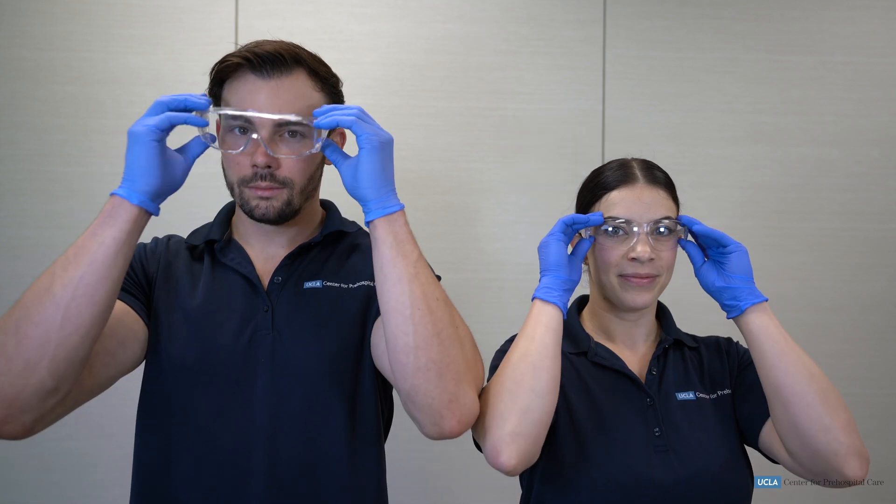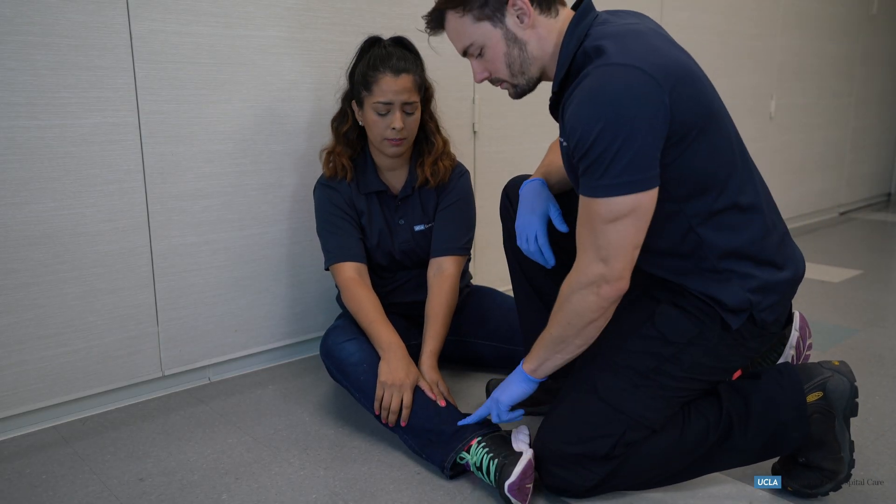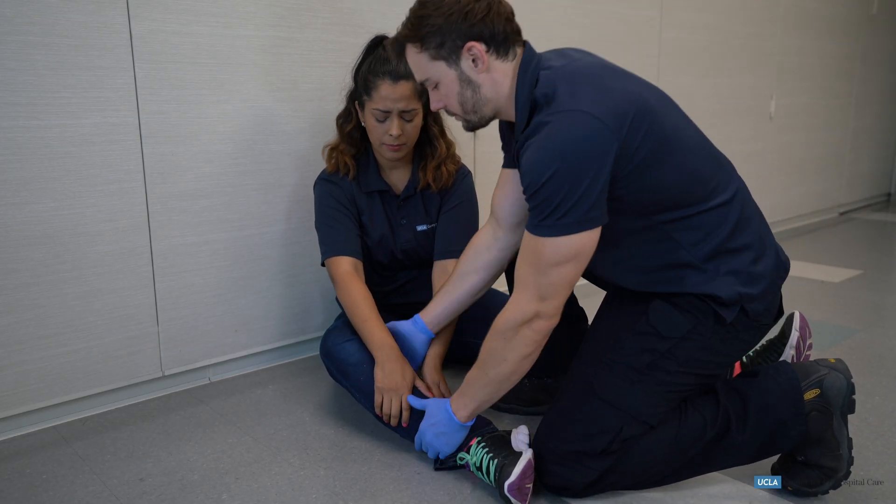The EMT takes appropriate body substance isolation precautions. This includes gloves and eye protection. The EMT will then direct his or her partner to maintain manual stabilization of the injured extremity.